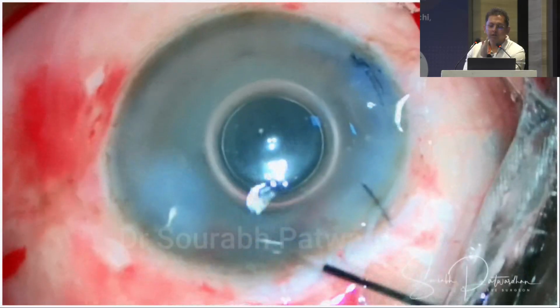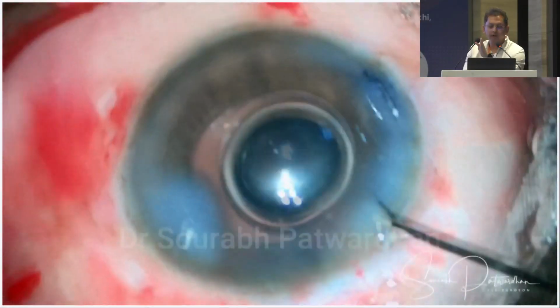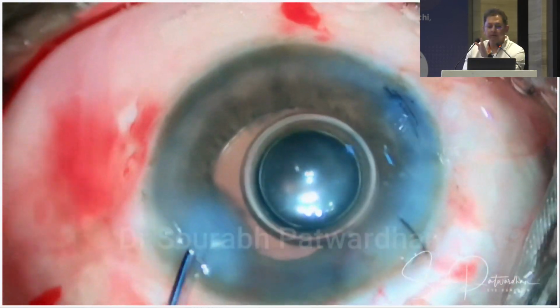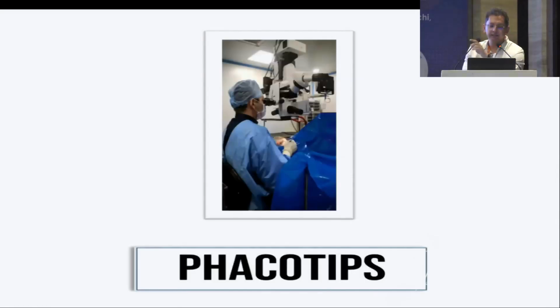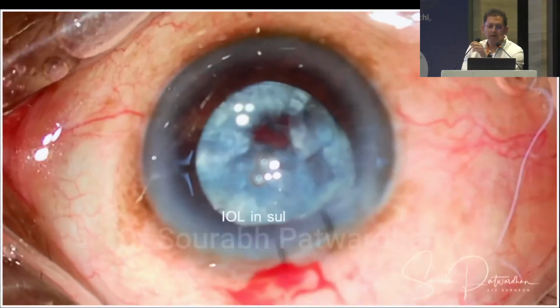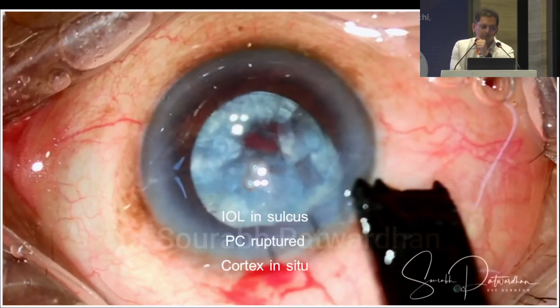So always after any anterior vitrectomy case, make sure you put a little bit of diluted triamcinolone in the anterior chamber to look for any residual vitreous, sweep under the incisions and check there are no strands there. So these are good habits to have. The little bit of triamcinolone crystals which are left are very good for reducing the inflammation post-operatively.